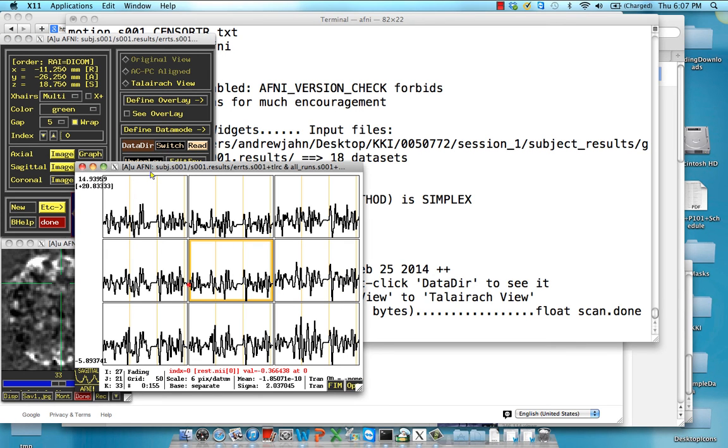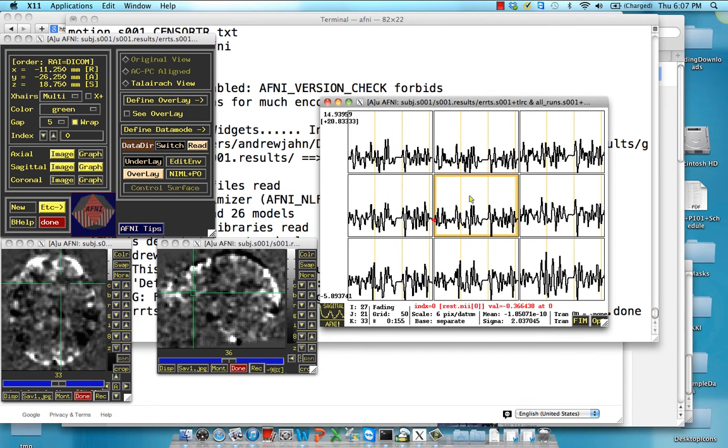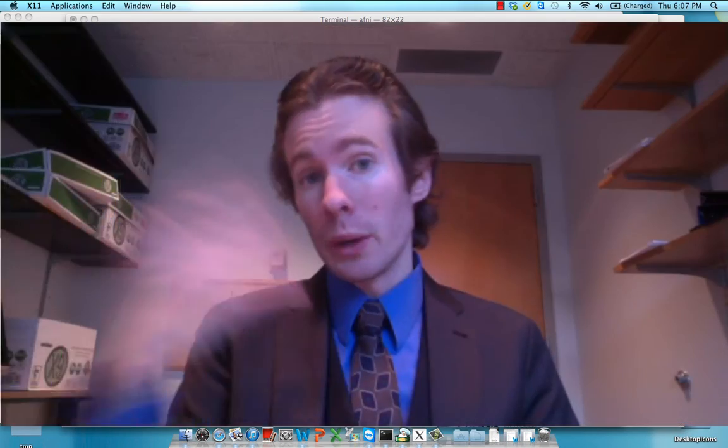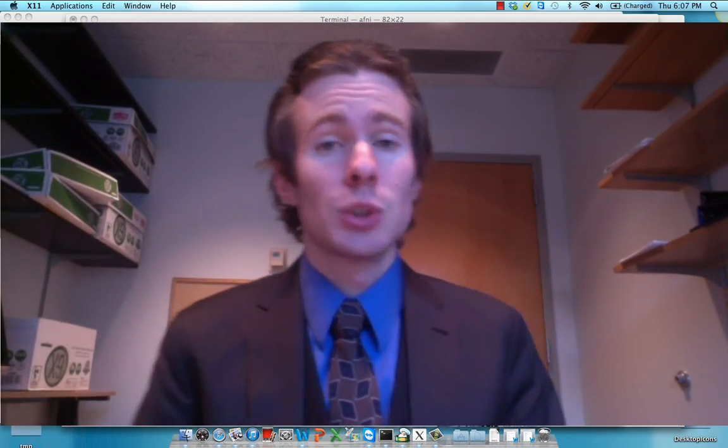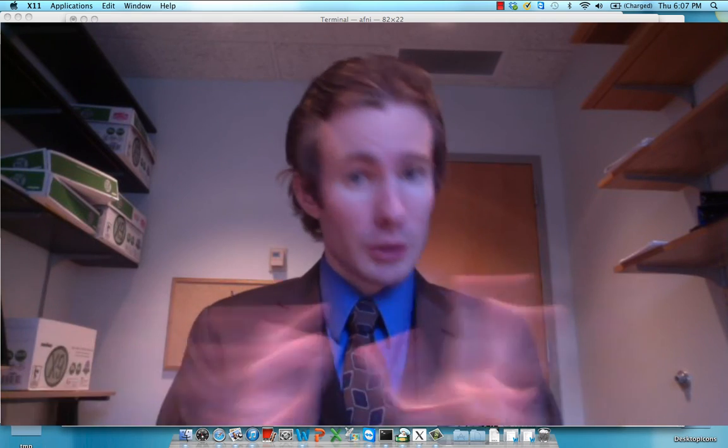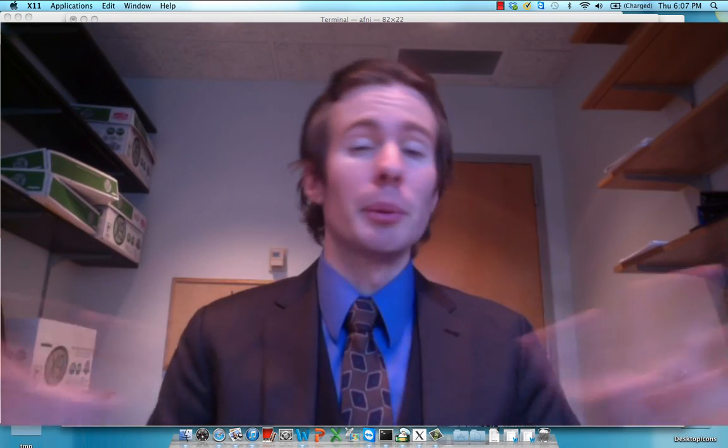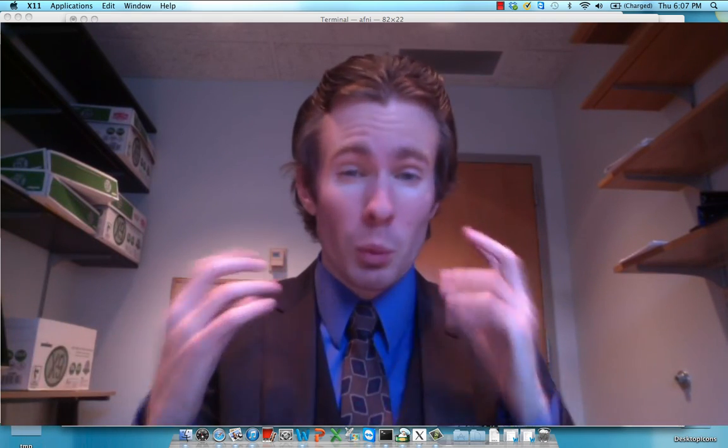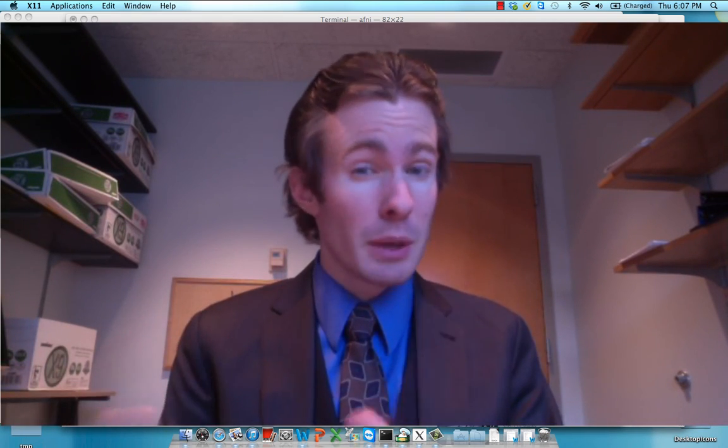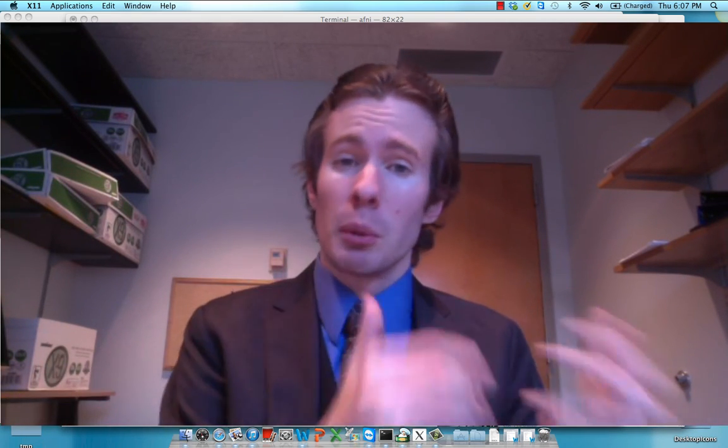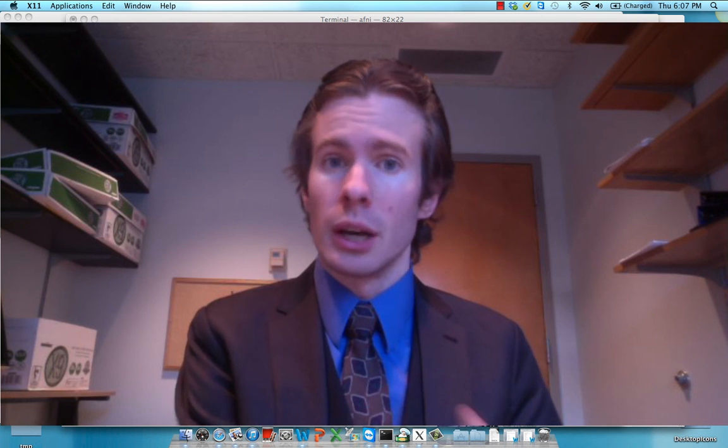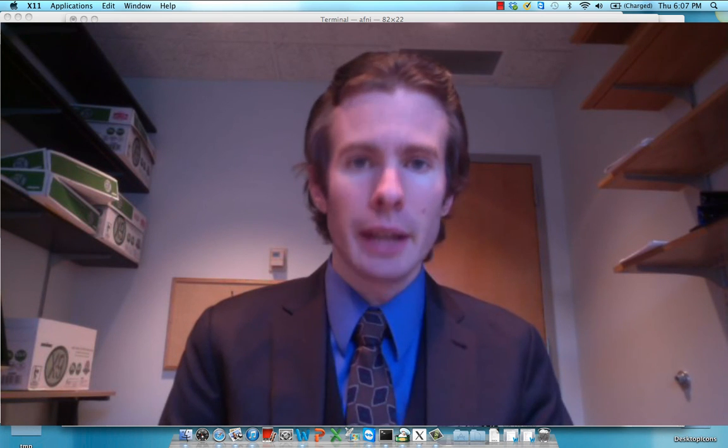In these time courses, we can select a specific region or a voxel, and we're going to be correlating these time courses across the brain. We'll get into that in the next tutorial, but just right now I want people to be clear about what exactly is being modeled and what we're going to be focusing on for the resting state analysis.